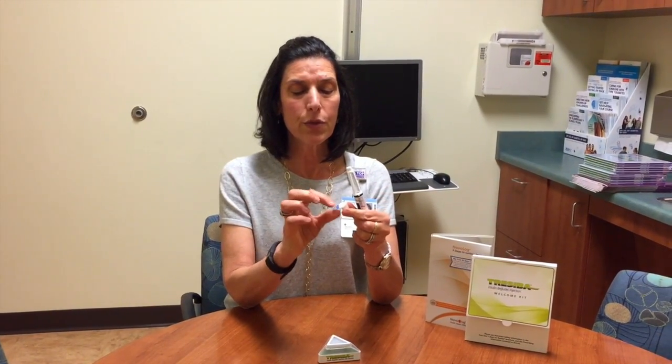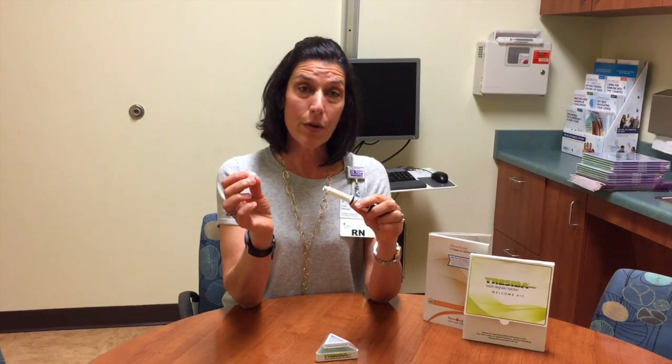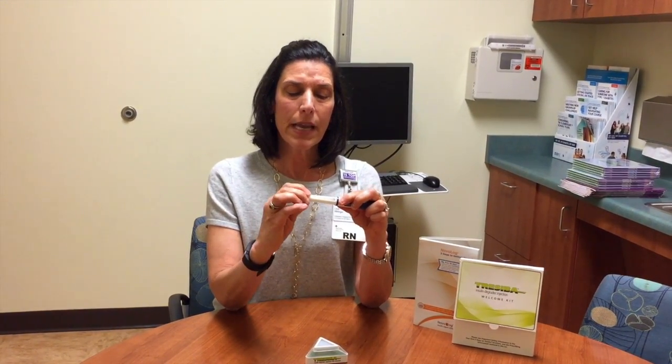Then what you're going to do is grab your pen needle. There's a little blue paper tab on the outside of the needle — I just want you to pull that tab off. There is an outer pen needle and an inner pen needle cap. Take the needle and press then turn clockwise until it stops turning. Then take the outer pen needle off and just place it on the table near you.